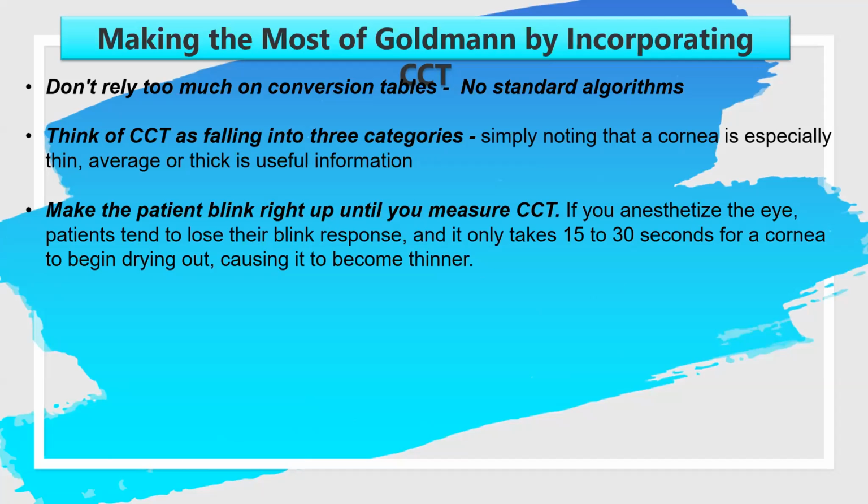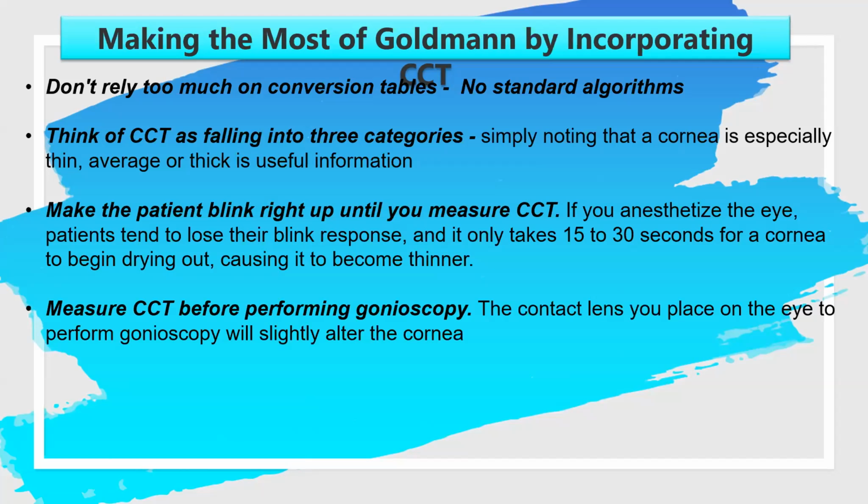The third important point is that once you have anesthetized your patient, either measure the corneal thickness immediately, or if you are delayed for some reason, ask the patient to blink frequently, because if the cornea dries up, the corneal thickness becomes lesser. You don't want this to happen.